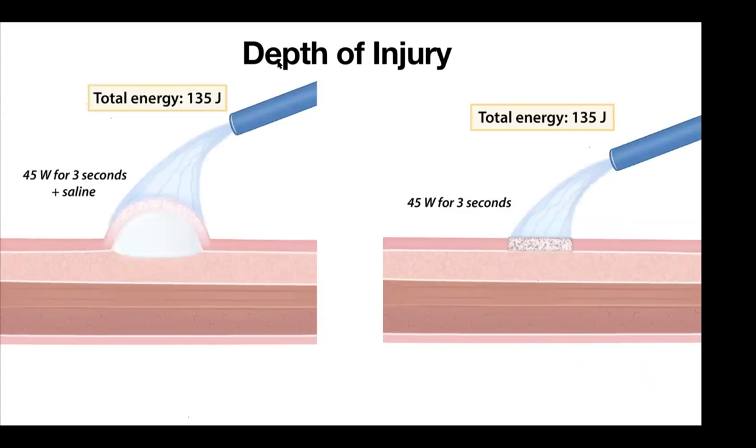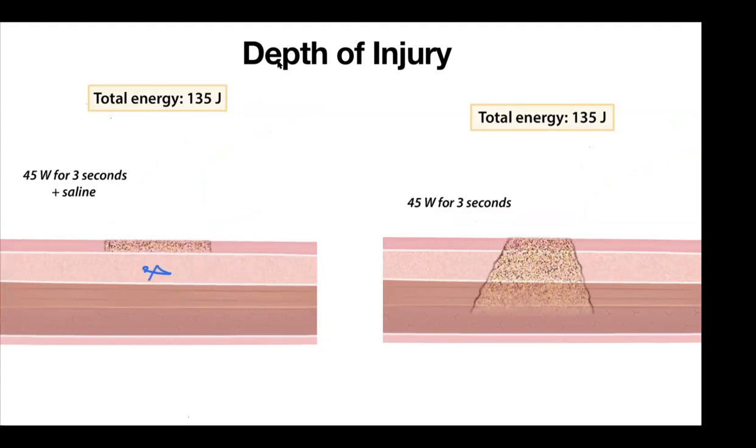So the same concept, again 3 seconds, but here we applied 3 seconds of energy after creating a submucosal saline bleb or some solution to lift the mucosa away. When you do this, what happens is you protect the deeper layer from damage. So this is a concept that you want to keep in mind. And this concept actually was shown by the group at Mayo a long time back, almost 20 years back.